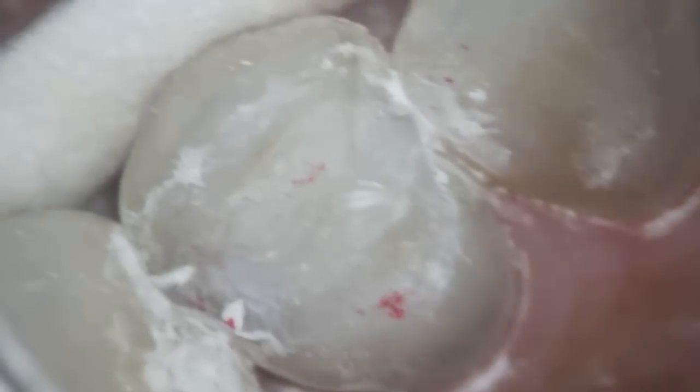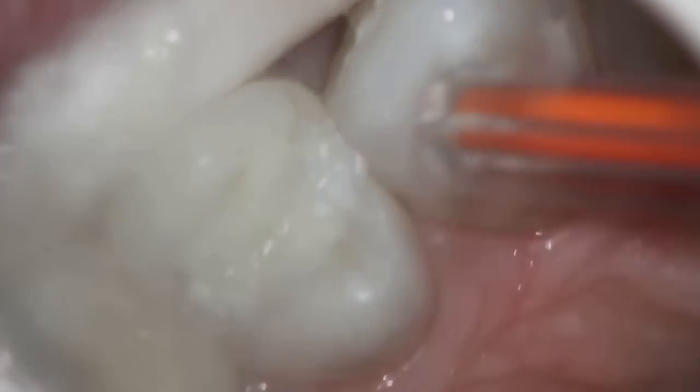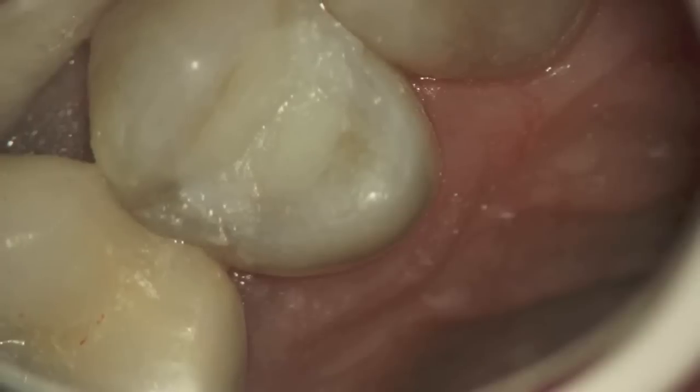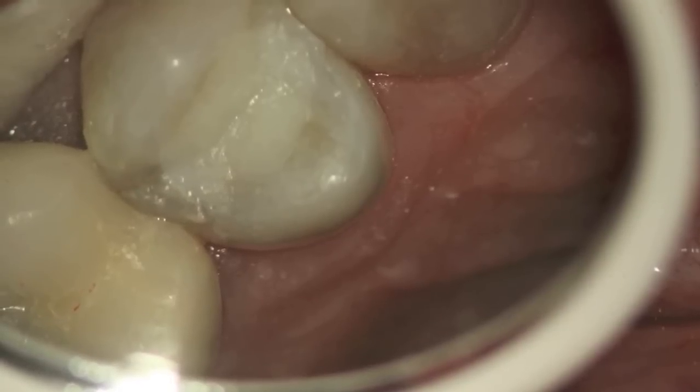That's what the red dots are that you see — it's the patient biting down and making sure they're not hitting anything too hard with regards to the filling. And when we're finished, we go ahead and polish it so that it's nice and smooth and won't have any irritation to the patient's tongue. And there you have it — it's polished, looks nice, and should last until we do the crown or onlay.